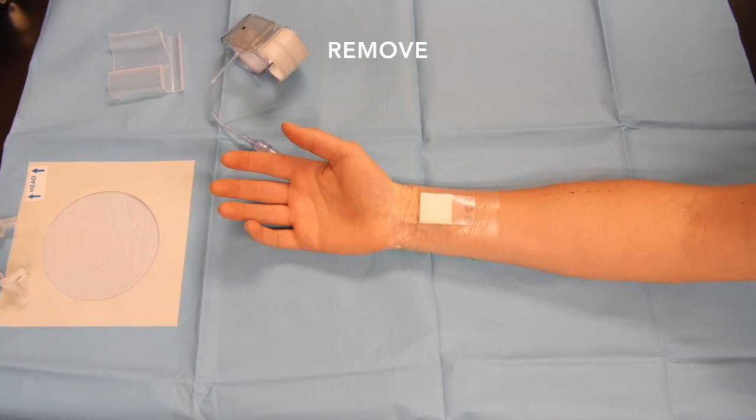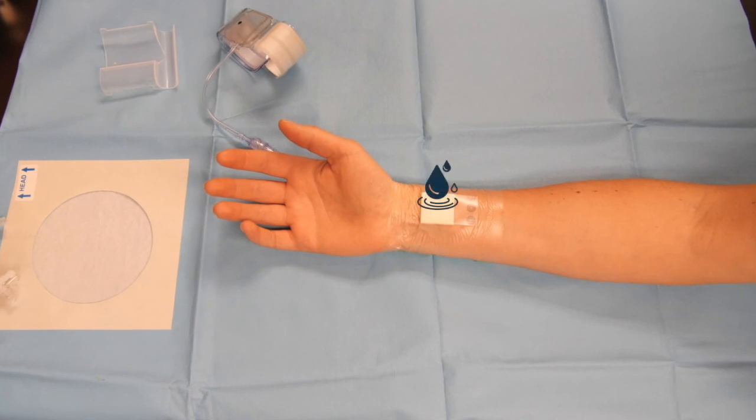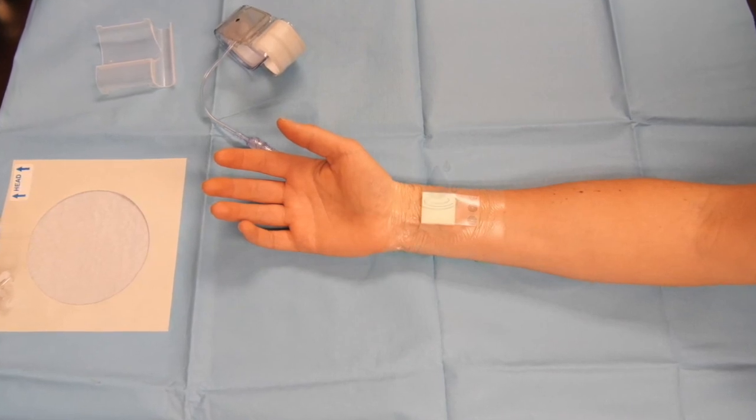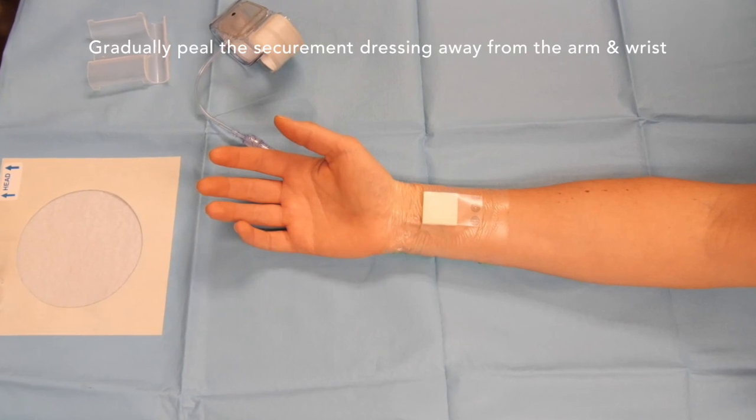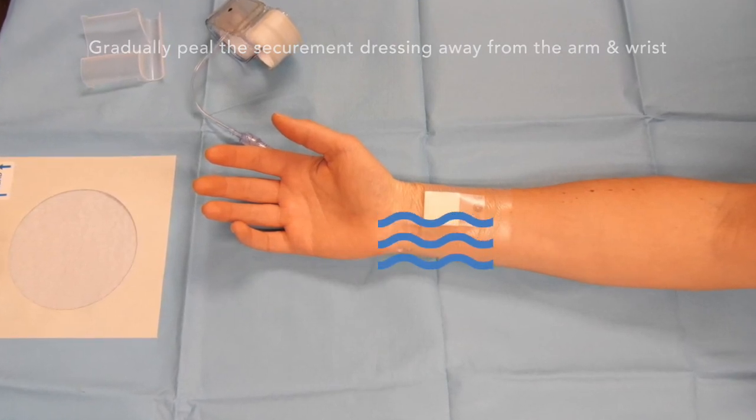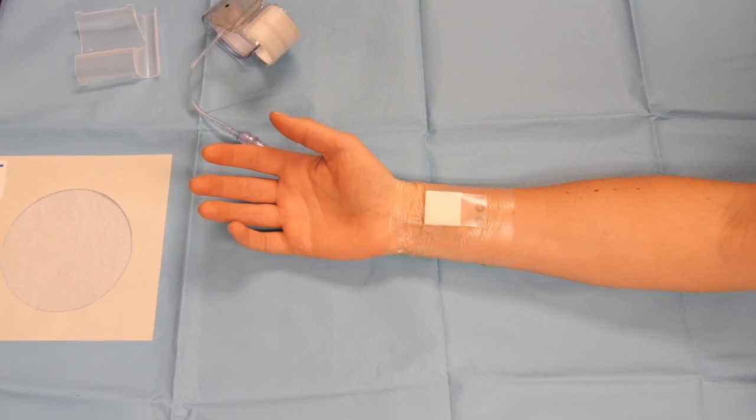To remove the patch and securement dressing at 24 hours, apply running warm water over the dressings. With water running, gradually peel the securement dressing away from the arm and wrist. Under the running water, the patch can then be readily eased away from the underlying wound, leaving the scab in place.